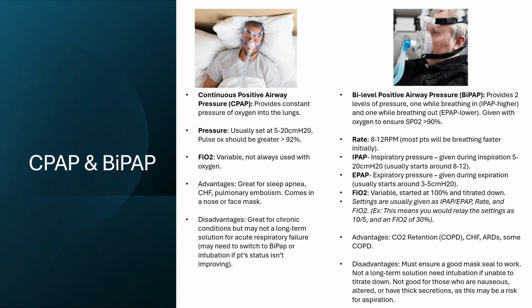But most patients that are on BiPAP are going to be hooked up to an oxygen source. Sometimes you might see this with patients at home and they are not hooked up to oxygen. I would say 95% of my patients are always hooked up to oxygen. So your FiO2, again, it's going to be variable, but most are going to be hooked up to oxygen. So you're going to start at about 100% and then titrate down.